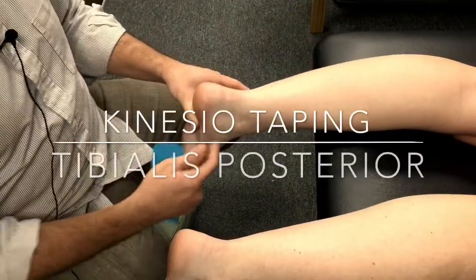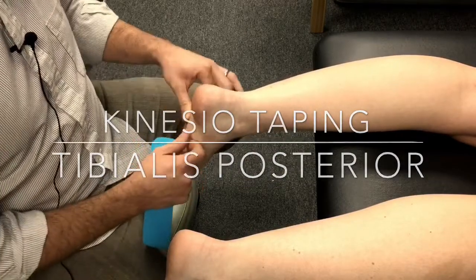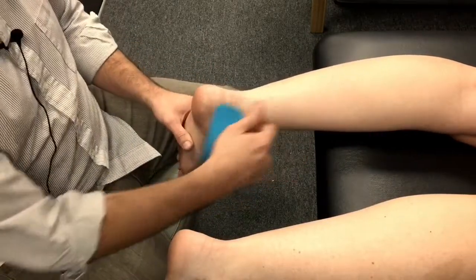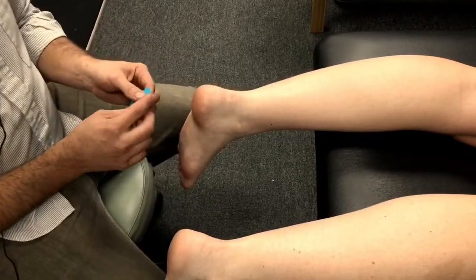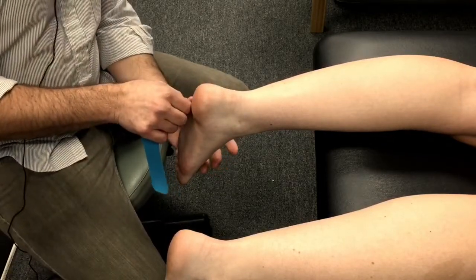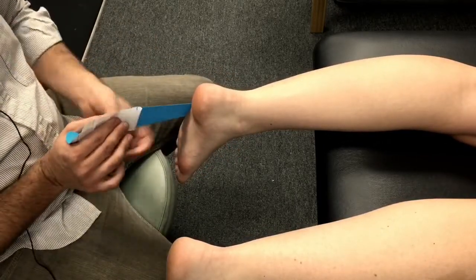We're looking at kinesio tape here and we're addressing the posterior tibialis. One of the uses is to support a tendon, and this is what we're doing here. We want to find the place where we want to put it — I've already cleaned the foot. For posterior tibialis, I like to start on the top of the foot, as it helps it stick on a little bit better. If it's on the bottom of the foot, it tends to come off quicker.